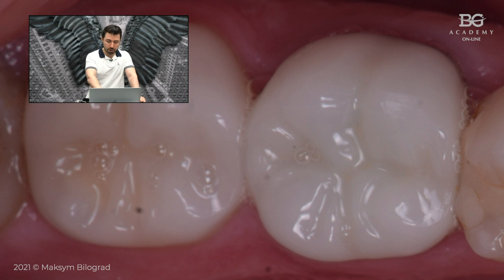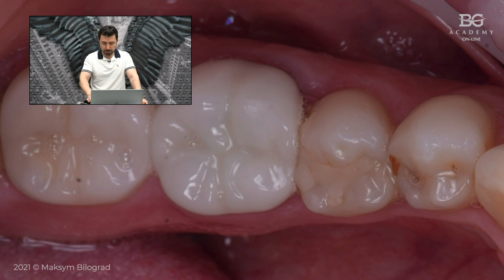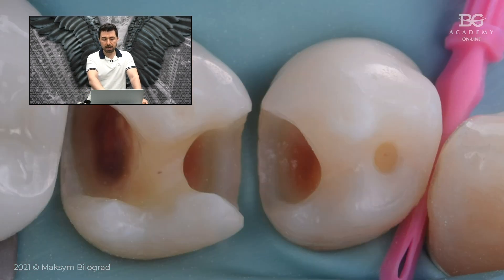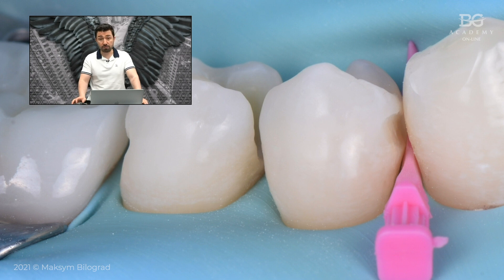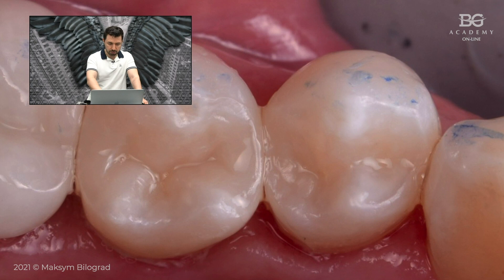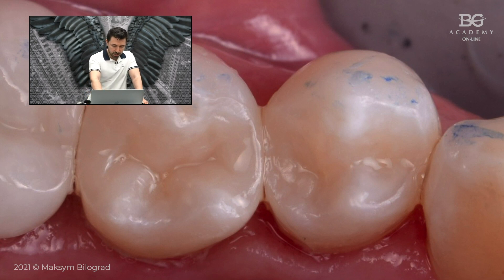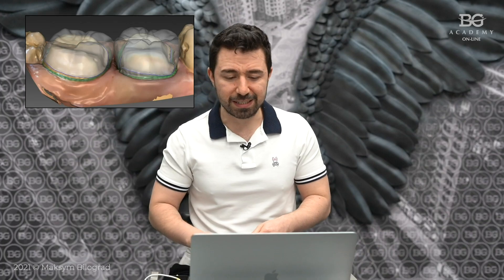Here you can see the restorations after bonding. At the next appointment we didn't have enough time to treat the premolars, so we scheduled that for the following visit. The patient came back, we made preparations, removed caries defects, and made some interesting vestibular access preparations for the class II caries defects. This way we preserved the mesial ridge, which is important from a biomechanical perspective. Here you can see the final result after composite restoration polishing. So in this case we combined direct and indirect restorations — using ceramic crowns and direct composite restorations in the same patient.